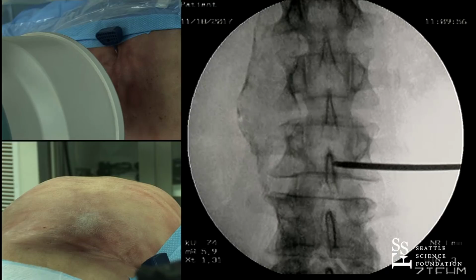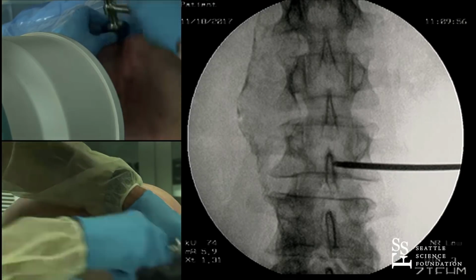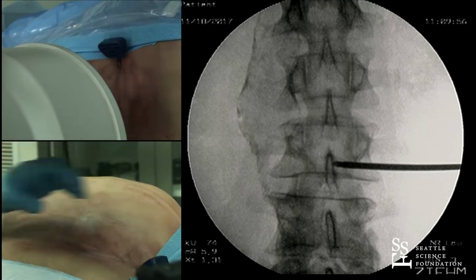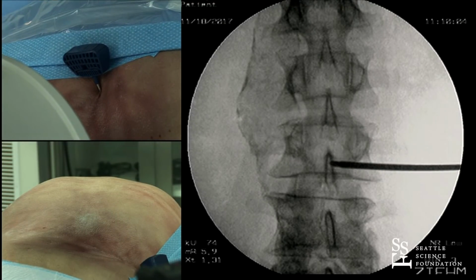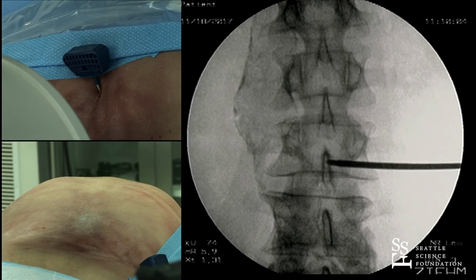You can really rocker arm this over because the vertebral body osseous cortex on here is very thin, and you can change the trajectory of that needle very easily. So can we save that, and let's go lateral. And it looks like you're using a bevel tip.